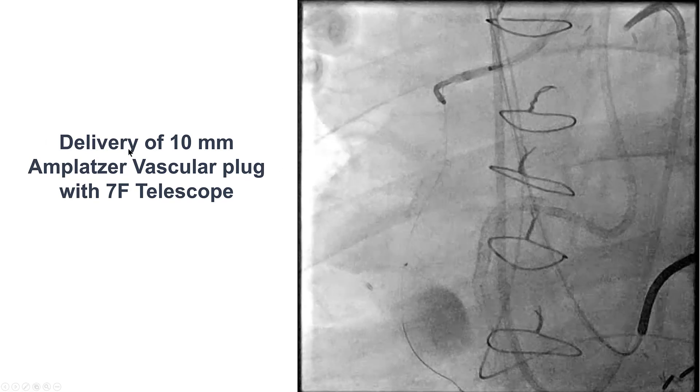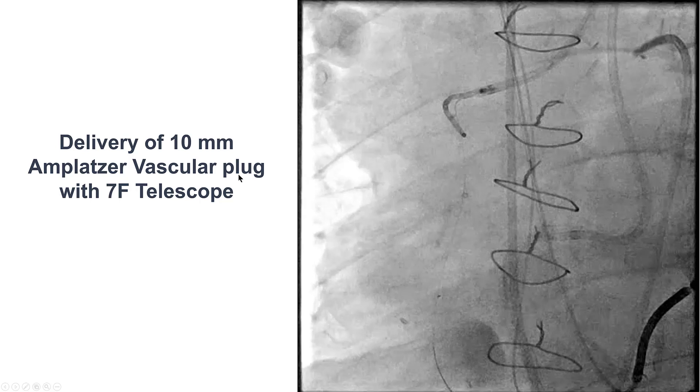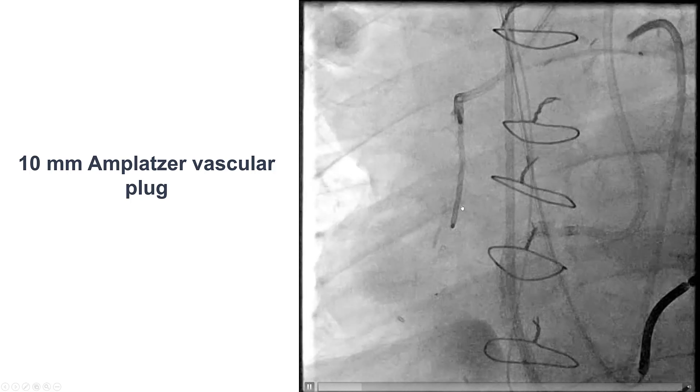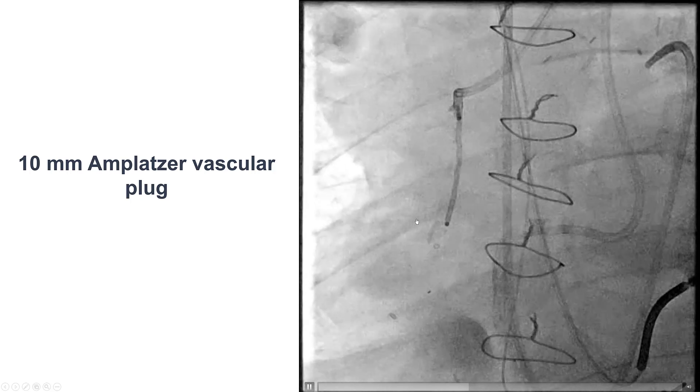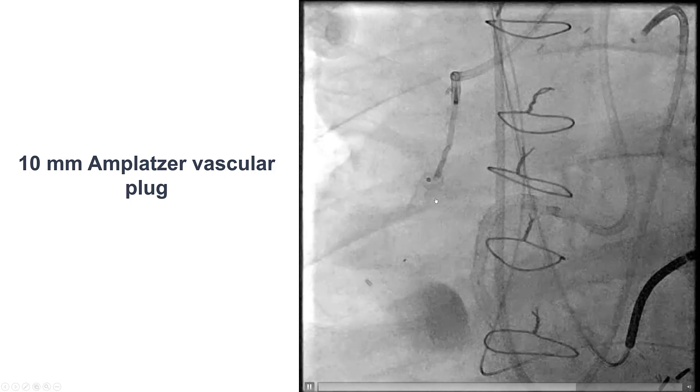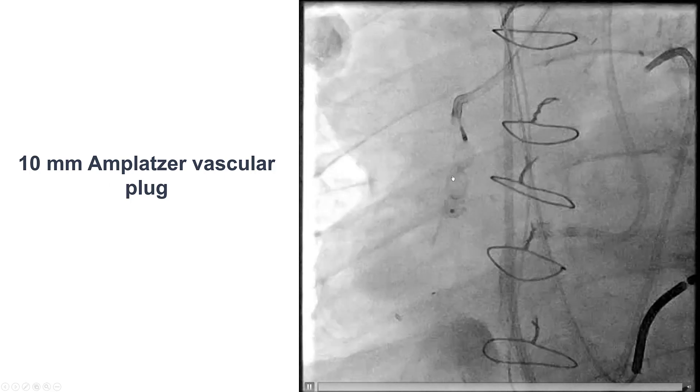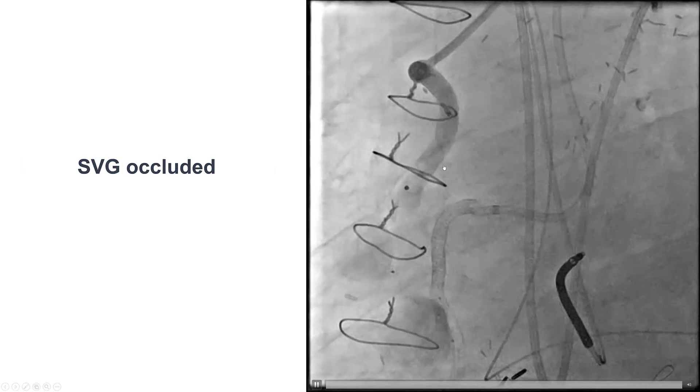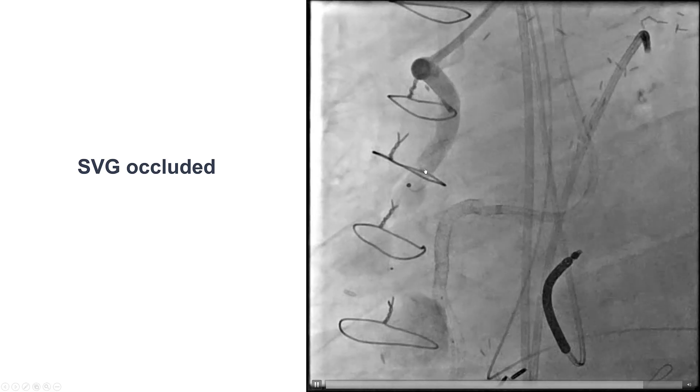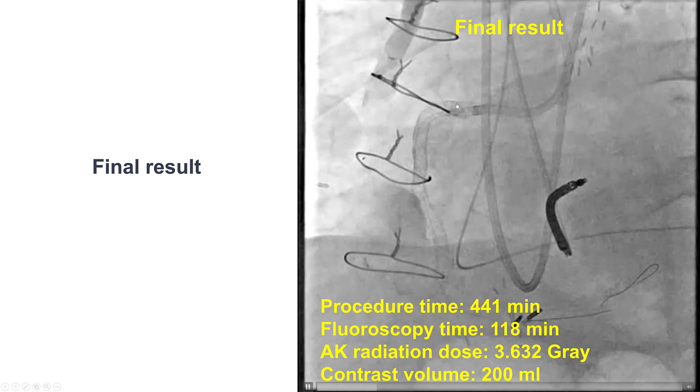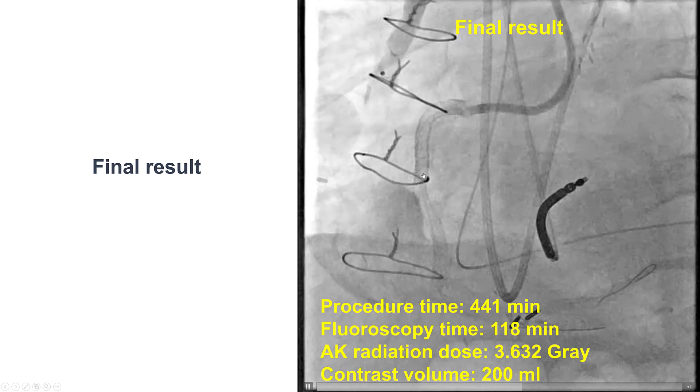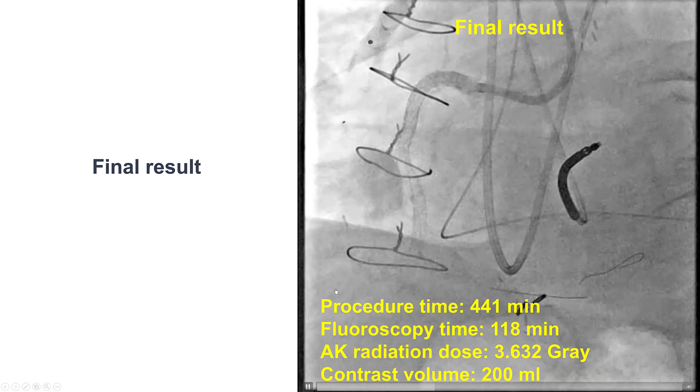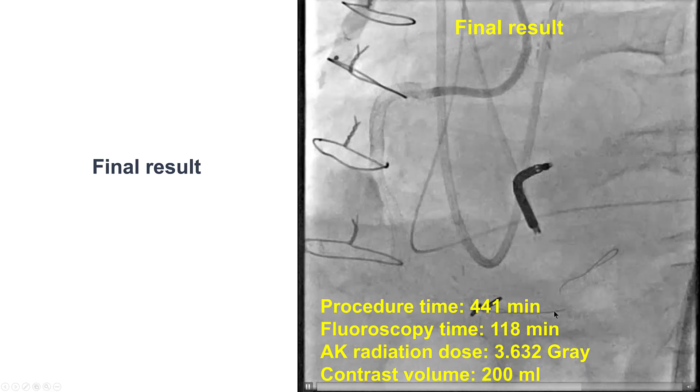We then proceeded with delivering a 10-millimeter Amplatzer vascular plug through a 7-French telescope guide extension. Here it is. And then that was unsheathed, essentially deploying the Amplatzer vascular plug into the proximal portion of the aneurysmal saphenous vein graft to the right coronary artery. And that led to successful occlusion of the aneurysmal saphenous vein graft. This was the final result. We do have good flow through the native right coronary artery. There is some retrograde flow into the aneurysmal SVG, but there is also good antegrade flow to the distal right coronary artery.